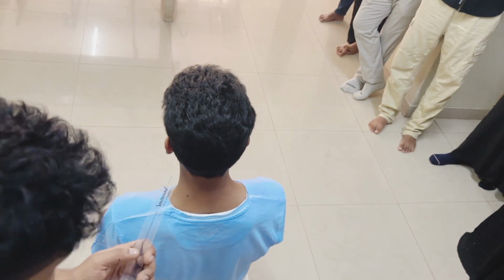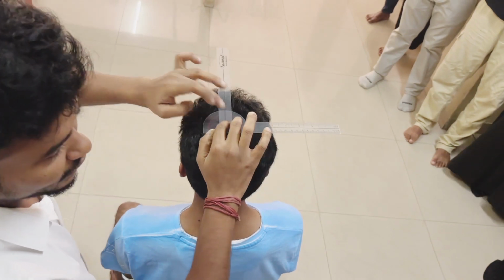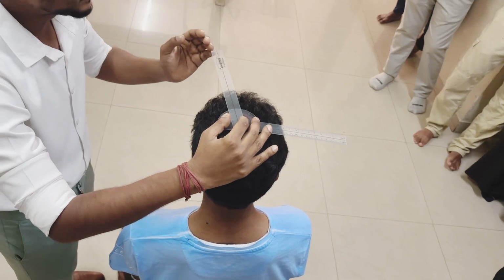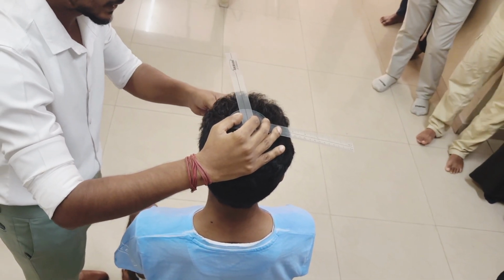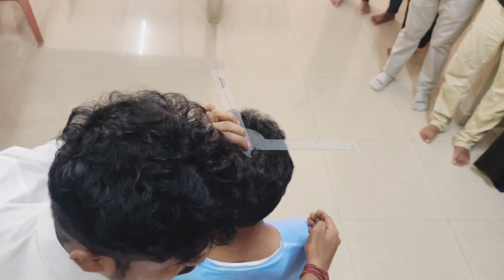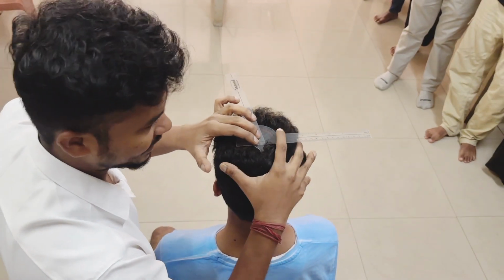After that, we take the 90-90 degree position. We keep the fulcrum at the center of the cranium. The movable arm will be at the center of the nose, and the stable arm will be parallel to the acromion process. So this is the patient position and the goniometer position.